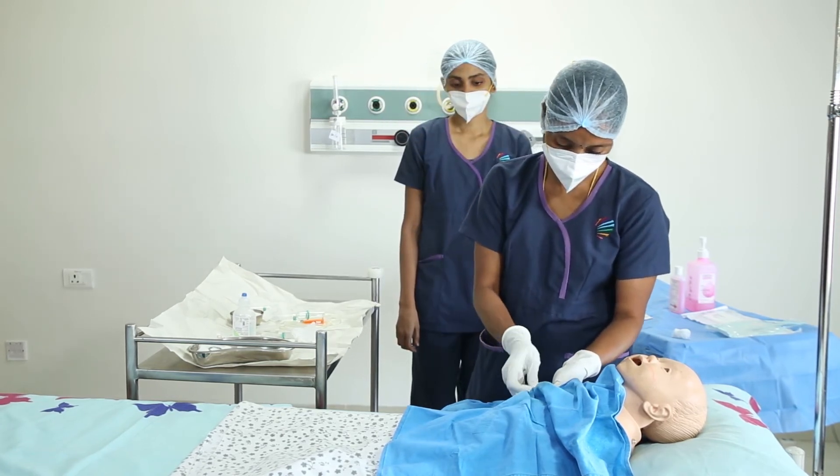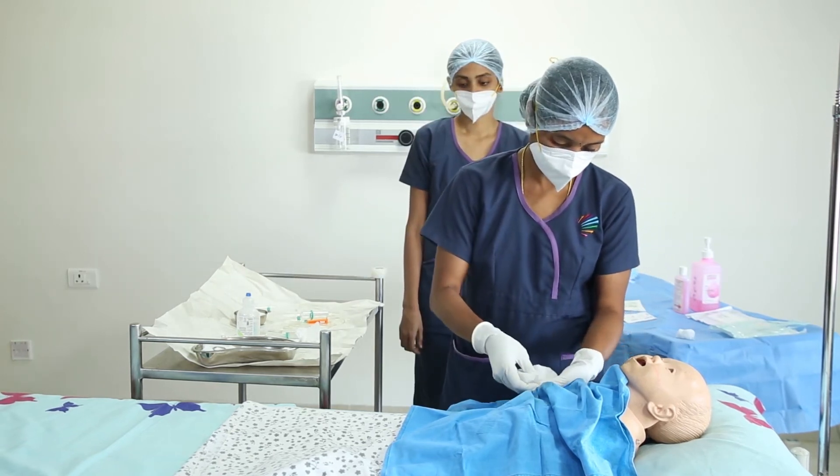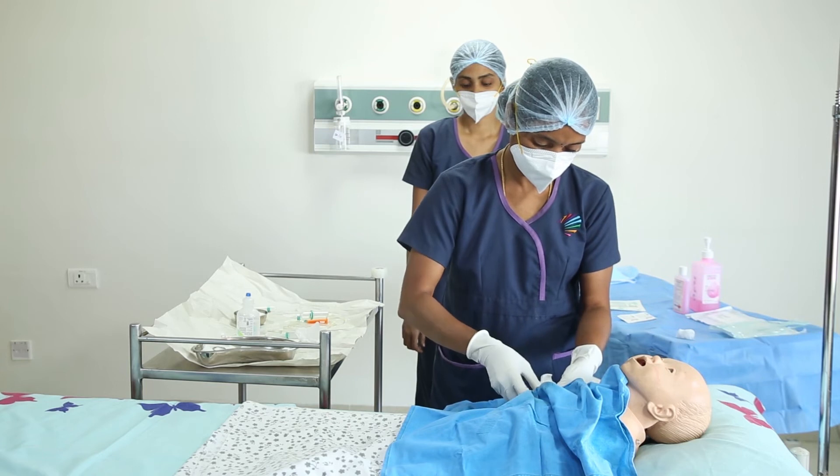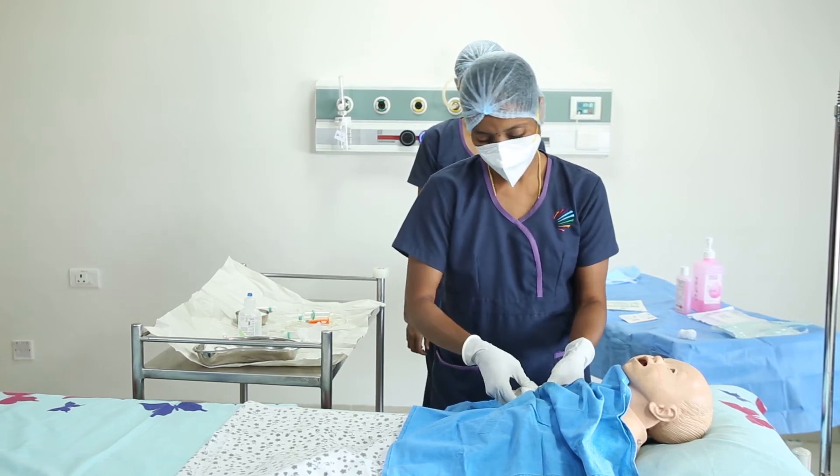Always clamp the line in the thickened reinforced area. Always use 10cc syringes to access the central line so as to avoid pressure-based damage. The same procedure needs to be followed for each lumen.